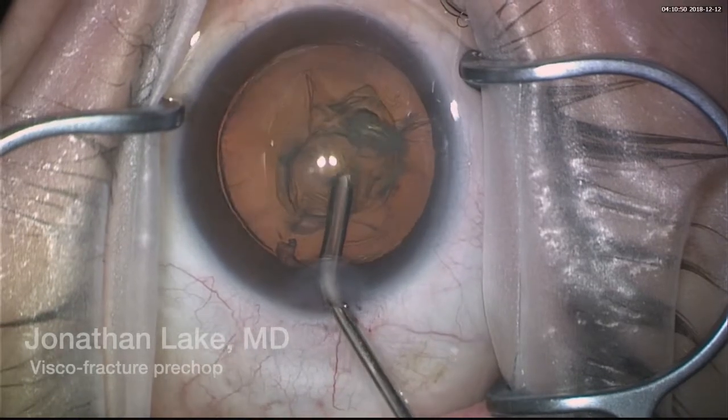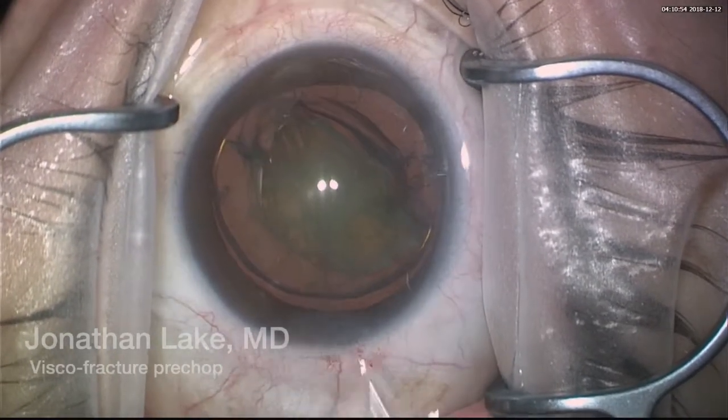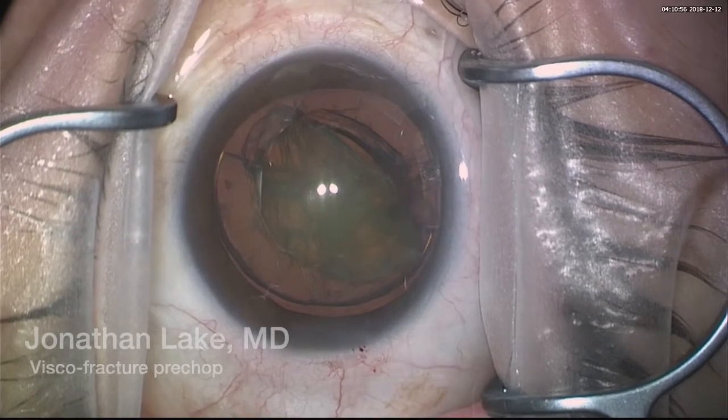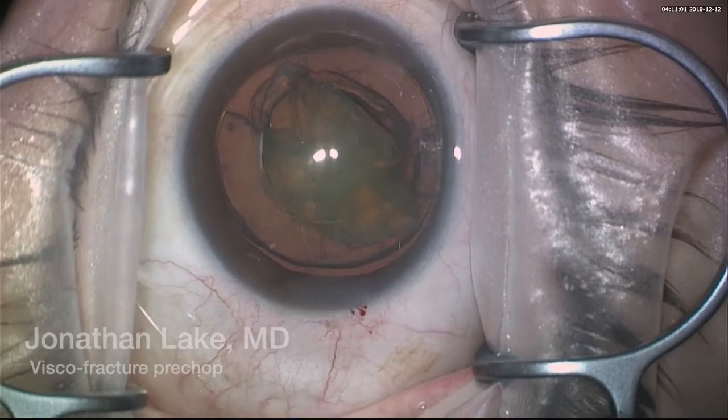Look at how it separates into two nice halves, and therefore we can proceed straight to the phacoemulsification.